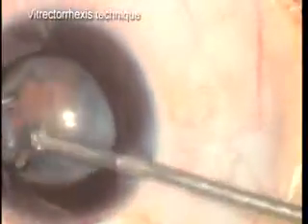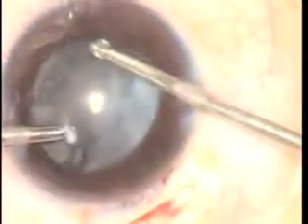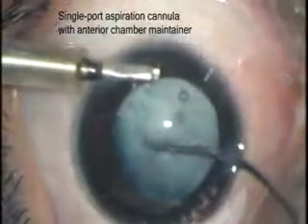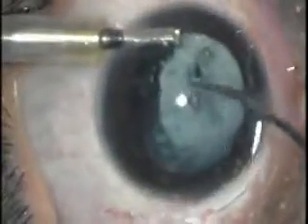The vitrectorhexis technique can also help to manage the careful tearing of the lens capsule. In paediatric subjects, a multi-quadrant cortical cleaving hydrodissection can be used to separate the adherent epithelial and cortical layers from the capsule, facilitating cortex removal. Apart from using the phaco handpiece without ultrasound energy, a single port aspiration cannula with anterior chamber maintainer often comes in handy for safe removal of peripheral cortex.